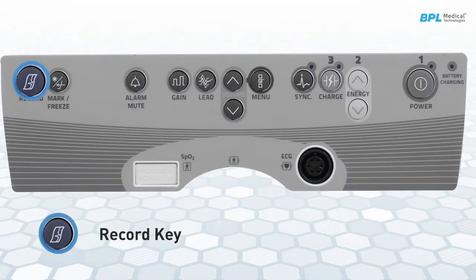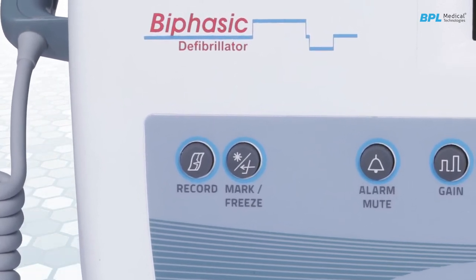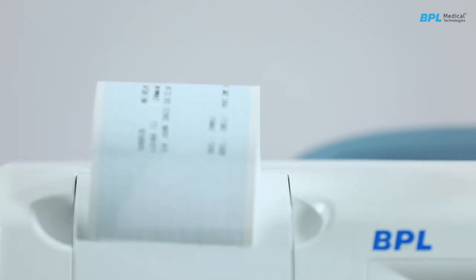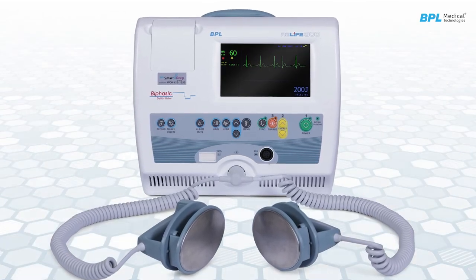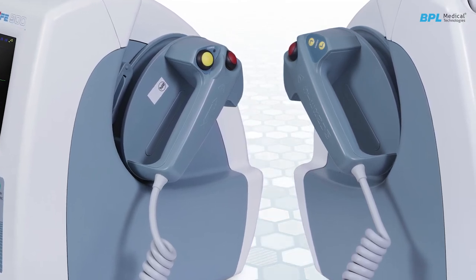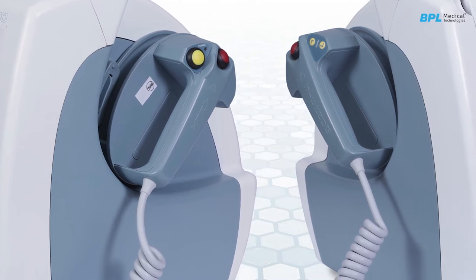Record key. This key is used for record functions. When this key is pressed, the recorder starts printing the present ECG data and status. When the recorder is printing, pressing this key will stop the printing. Shock initiates transfer of energy shock to the paddles. Two keys are present, one on each paddle. Both keys must be pressed simultaneously and held till the shock is given.